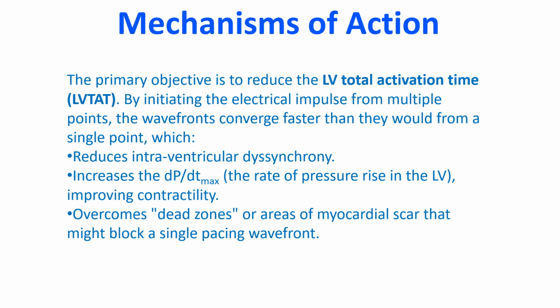The primary objective is to reduce left ventricular total activation time. By initiating the electrical impulse from multiple points, the wave fronts converge faster than they would from a single point, which reduces intraventricular dysynchrony, increases dP/dt max, the rate of pressure rise in the left ventricle, improving contractility, and overcomes dead zones or areas of myocardial scar that might block a single pacing wavefront.